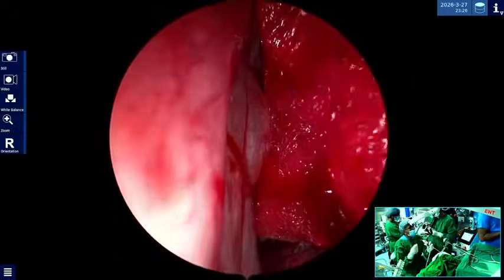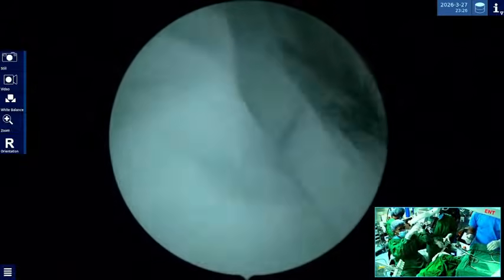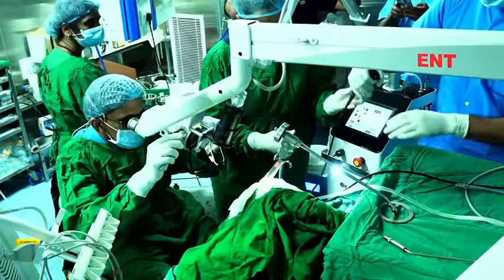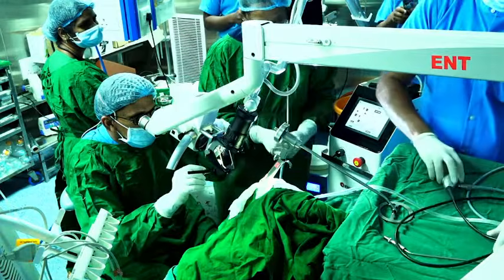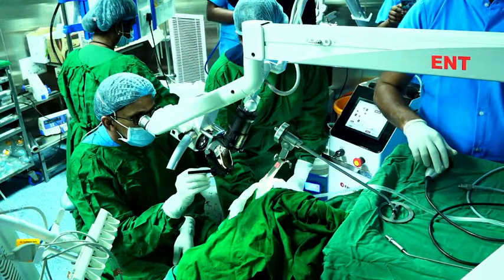Now we can put an incision and leave it. Instead of excising, you can just put an incision and leave it. So that will remove whatever that edema. See, this looks like more of an edema. Good.